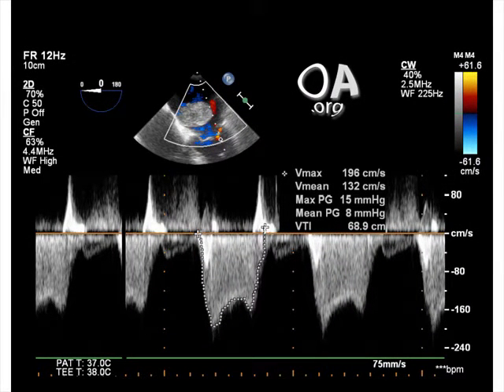This is the same mid-esophageal 4-chamber view with color as shown previously, but with continuous wave Doppler applied through the orifice of the mitral valve leaflets in order to evaluate mitral inflow velocity. After freezing the image and tracing the spectral profile, the TEE machine software performs calculations as noted on the screen.